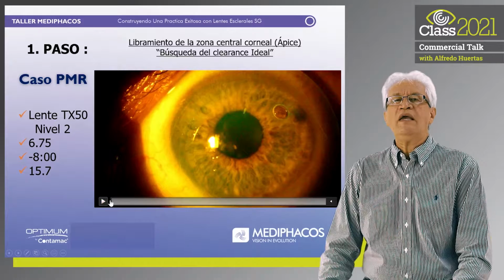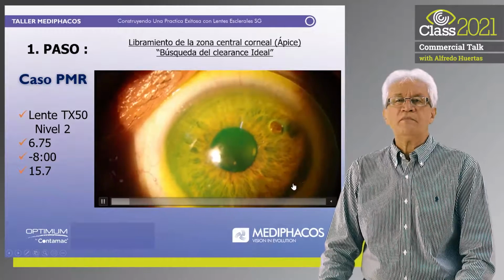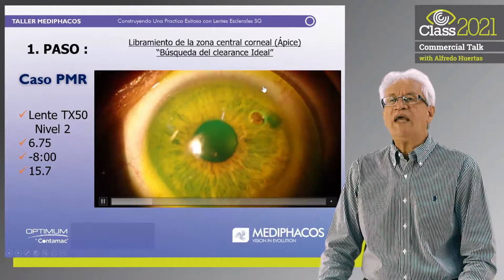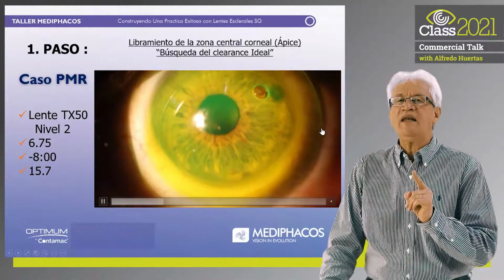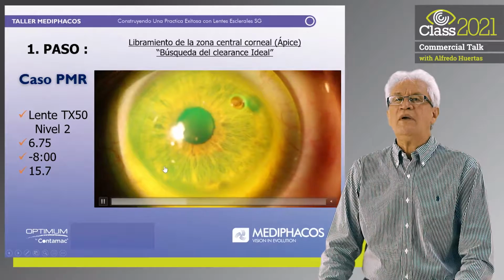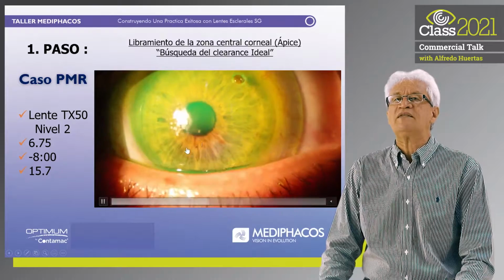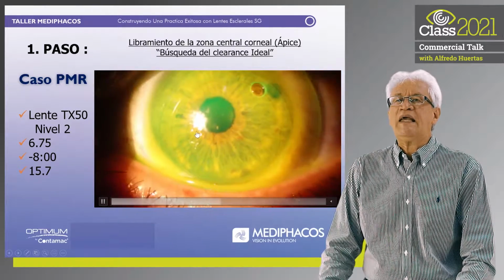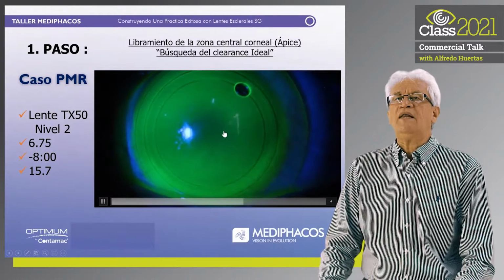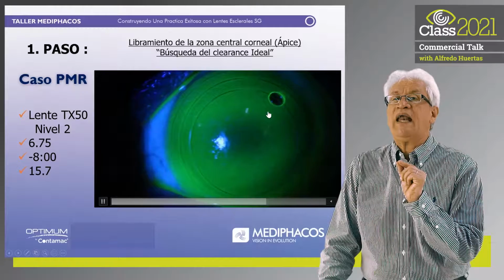And so let's watch the video and look at the findings. As you can see, there is a bubble, and of the lifting of the lens, despite having a good peripheral toric level, notice that the movement I make to the lens, to the center, it has a central touch which appears. I see the touch of the ectasia, and there you can see it. So this lens, I must modify the quadrants when I place the order.